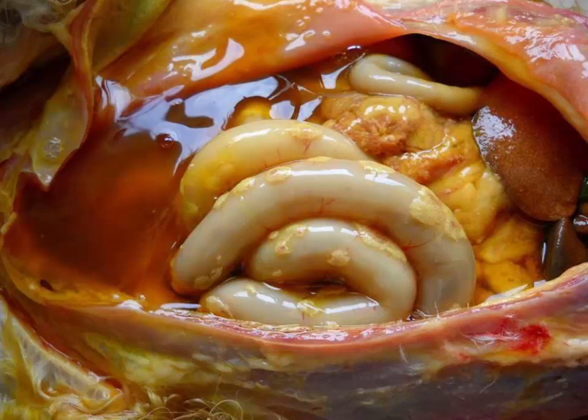Okay, time's up. This one, most people should be able to get. You look at this cat, the abdomen has been opened up. There is this gelatinous, honey-colored, high-protein exudate within the abdomen. That's a major clue. And then you have these plaques of fibrin throughout. This tells you there's a severe vasculitis going on. The morphologic diagnosis that I use is a diffuse exudative peritonitis with fibrinous serositis.